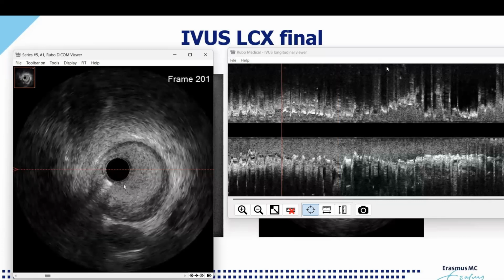And I can assure you, you can read the EBC consensus paper 50 times. If you use imaging, you can make an educated guess on where you want to land your stents. And as long as you make sure that you do not land your stent within a diseased segment, you will be good irrespective of whatever kind of stenting technology you use. But you need to look for it.